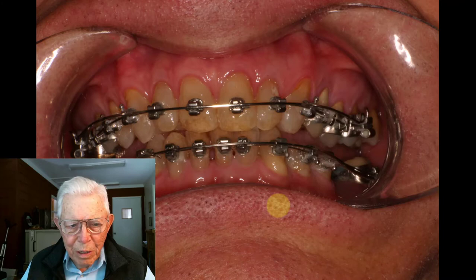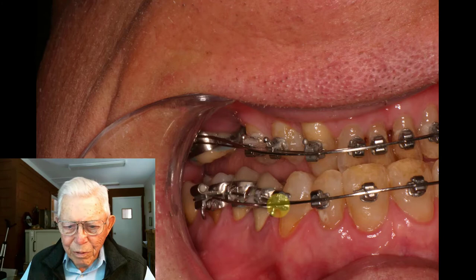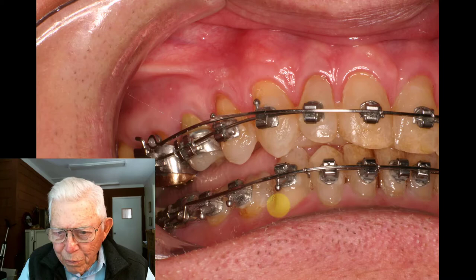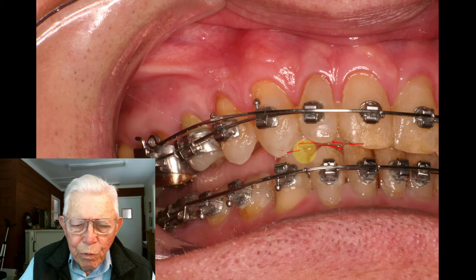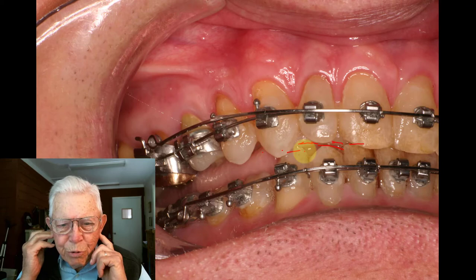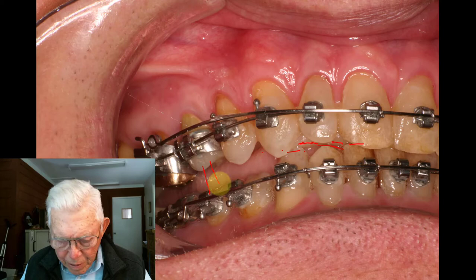We come back in a little bit later and we're getting down. We could see his lower front teeth coming up and biting underneath. You can see this block that we bonded up above — just a little bit of it there. We had him biting here, and this puts weight on the condyles back in the back. Your condyles touch and you touch up in the front. So somebody with bad joints couldn't do this — it'd be hard to do that without supporting the teeth in the back, and that's where it takes the load off.